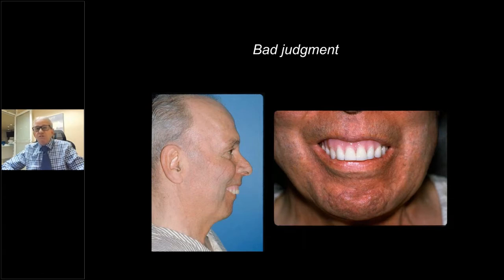The picture in the center or the picture to the right, you can look at this. I mean, he is banging into his lower lip, which he should not. You can look at the teeth where he actually took a file and he kind of ground his teeth to make them look more natural. The tissue is just showing way too much. It's incredible. The midline is off to the patient's left. All of this makes for totally a bad judgment.